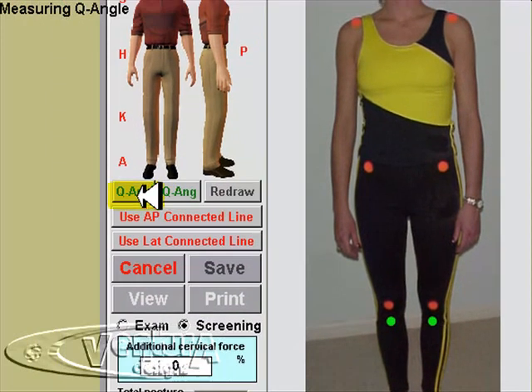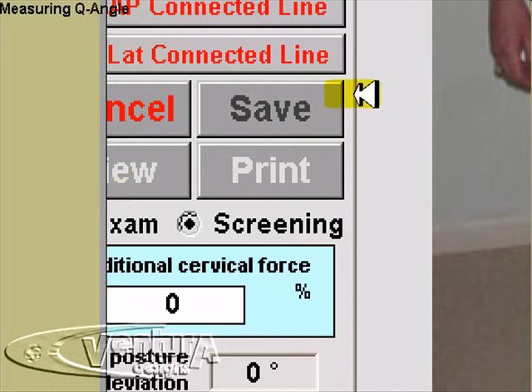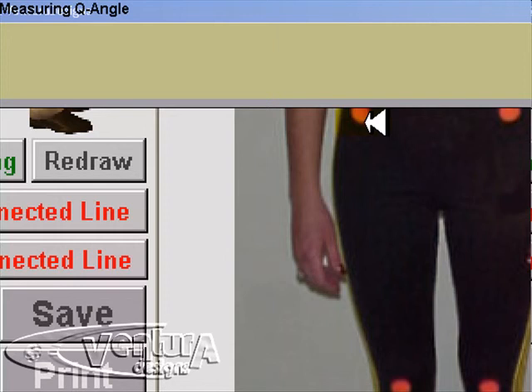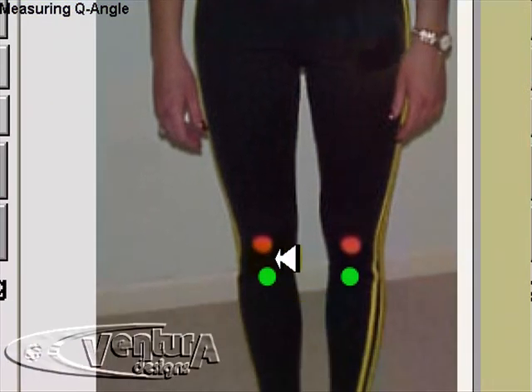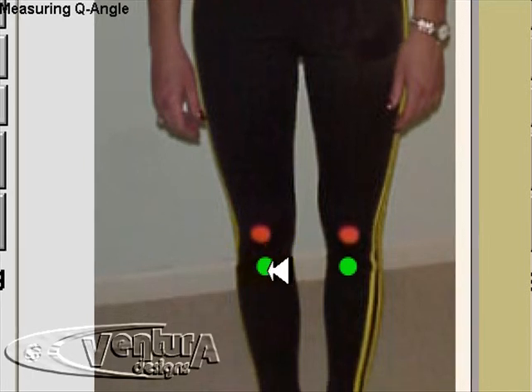When ready, click on the Q-angle button underneath the mannequin's right foot. This will zoom the picture in and change the mouse arrow to a crosshair. We always click from the top down, so we'll click on the ASIS point first, then click on the center of the kneecap, and next click on the tibial tuberosity.